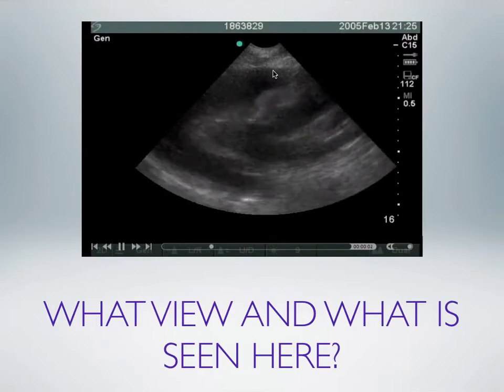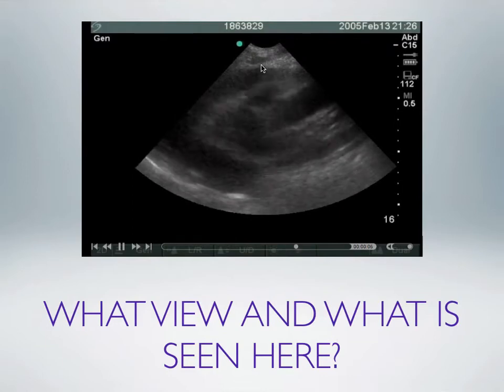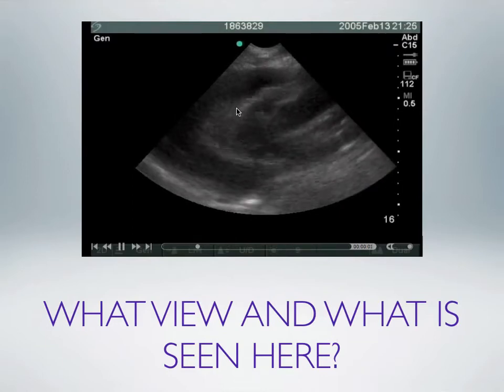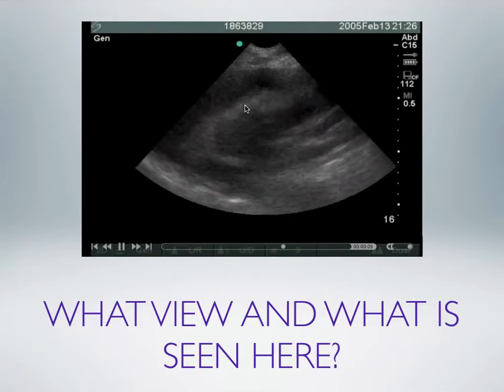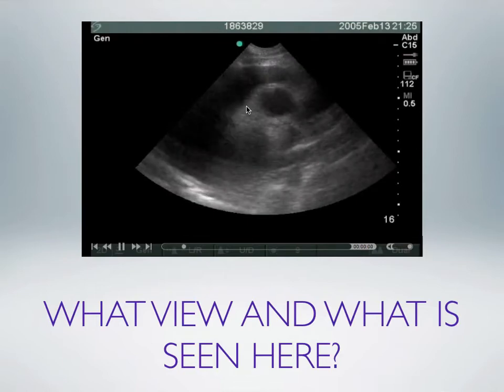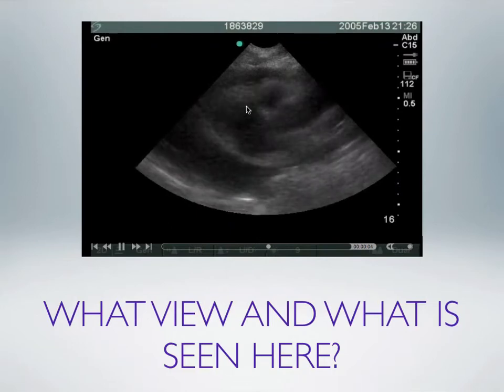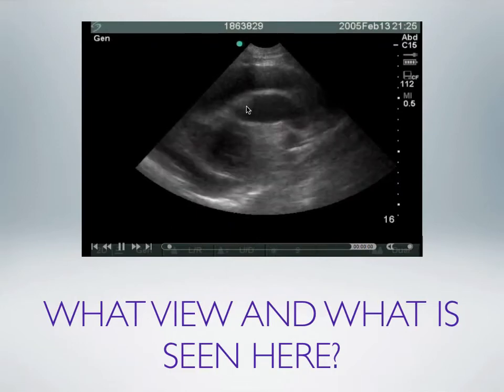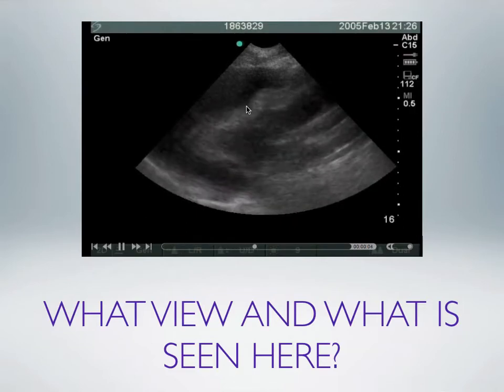Anterior chest up here. And all of this is fluid surrounding this swinging heart. And it looks like someone's jumping up and down on a trampoline at this part of the heart, the right ventricle. So this is somebody who has pericardial tamponade with the heart swinging, electrical alternans, and right ventricular diastolic dysfunction with right ventricular diastolic collapse.